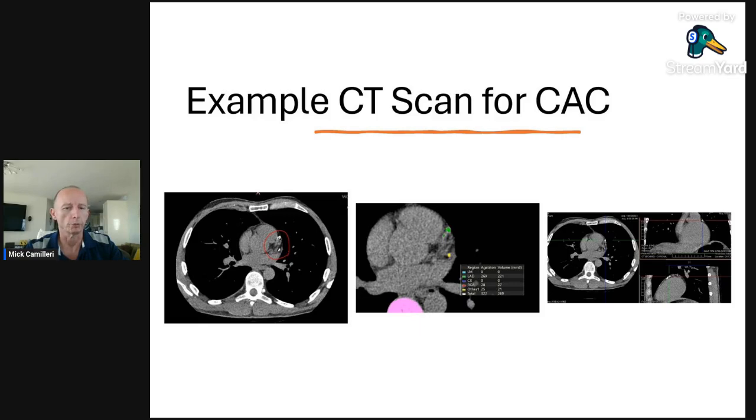There's soft parts of bone which are a bit darker, and the measures take into account for every slice how much of each level of brightness there is in that little area. I haven't zoomed into this, but if you look at the scans, you can zoom right in and understand that.